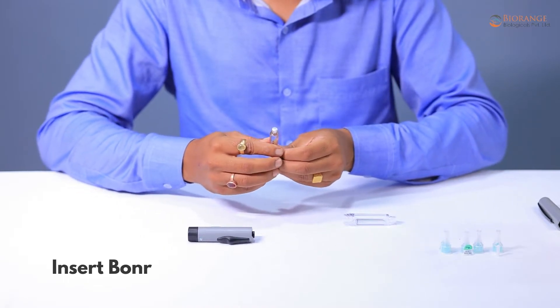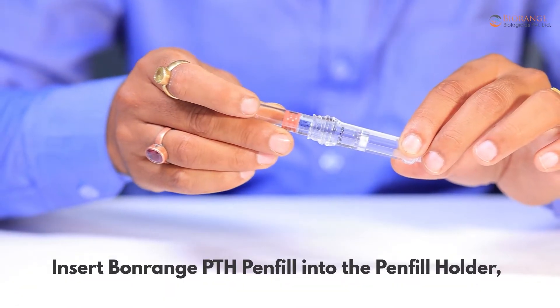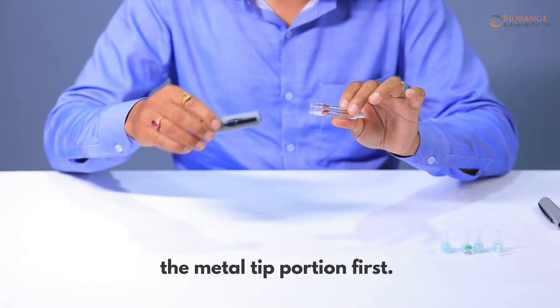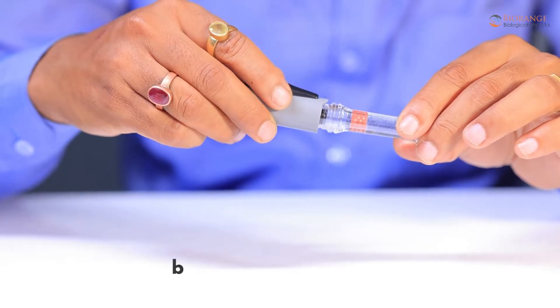Insert the Bonrange PTH pen fill into the pen fill holder, metal tip portion first. Then attach the pen fill holder into the pen body by turning it clockwise.